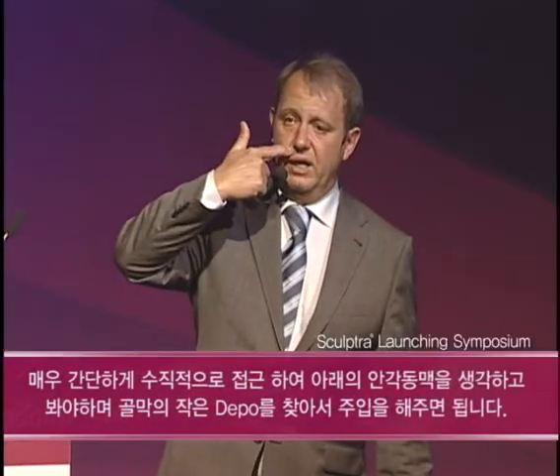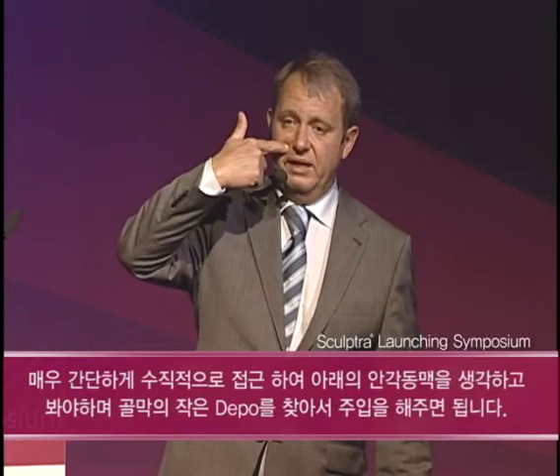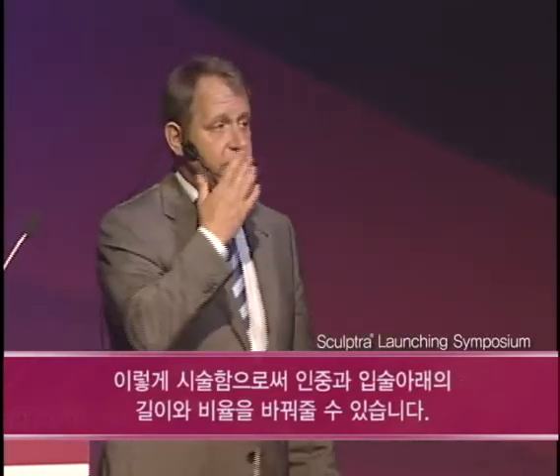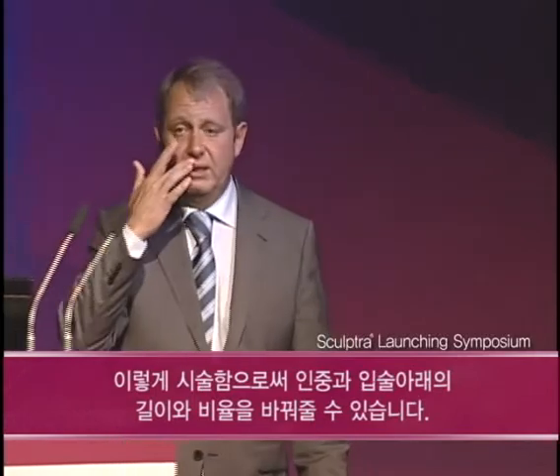Think about the angular artery underneath, and then a small depot on the periosteum. That is how you change position of nose, lengthening of the lip, and the ratio of the perioral region. Not with lip augmentation or thickening of nasolabial folds. You can do this. You have to do it on the skeletal platform.